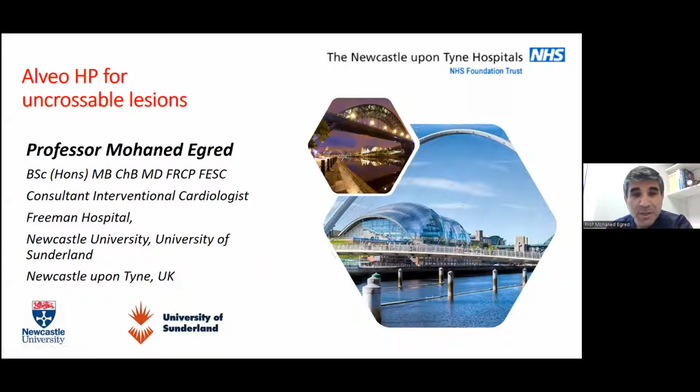Yes, and it's on the same theme as we've just been hearing. I thought the best thing to do is just to show some cases that we're using the right equipment and the right balloon to allow you to cross uncrossable lesions and CTOs would be very helpful.